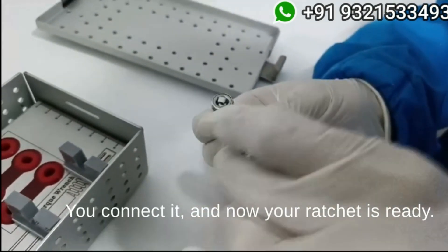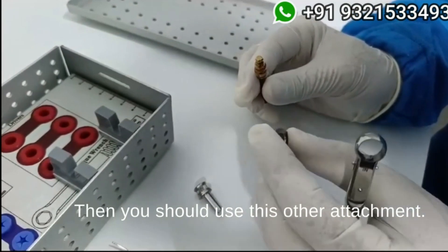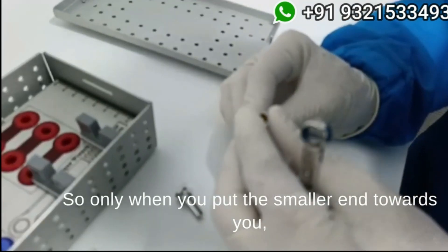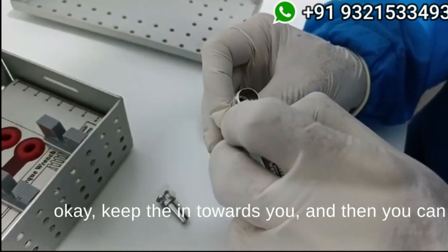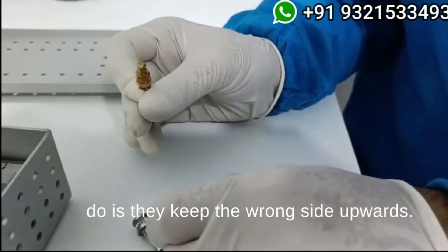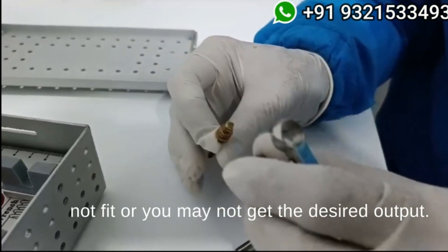Now if you want to ratchet the expansion screw, you should use the other attachment. Again, the smaller end should be towards you — only when you put the smaller end towards you can you easily slide and use the ratchet. A common mistake people make is keeping the wrong side upwards, and then when you put the ratchet it will not fit or you may not get the desired output.